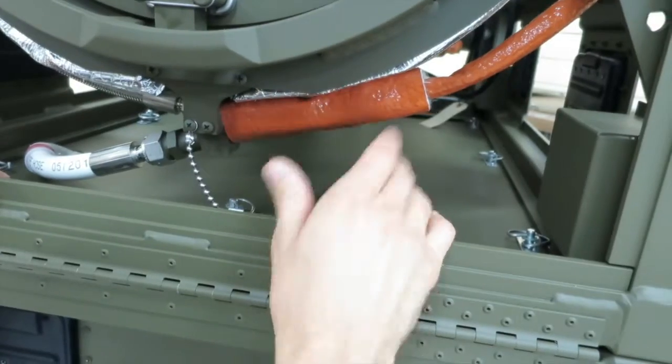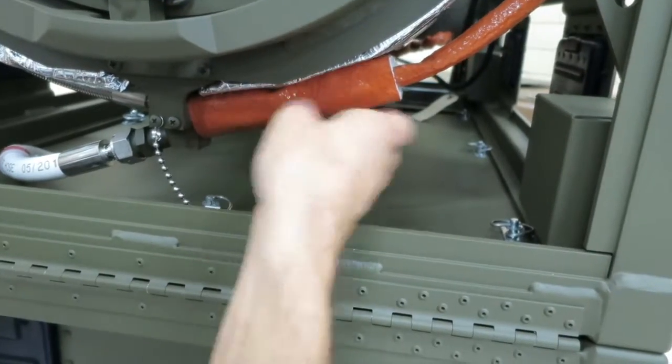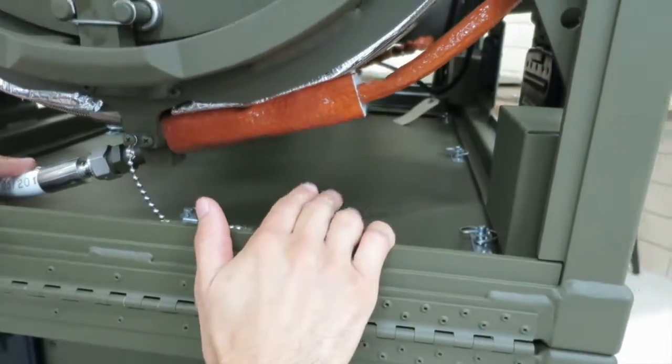all your bacteria. To replace this, we have a procedure, but you pull this large insulation this way and you'll see a swage lock nut that you can break and pull out the whole probe. And that's it for the front.